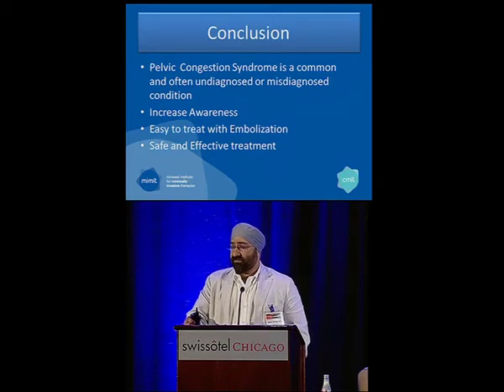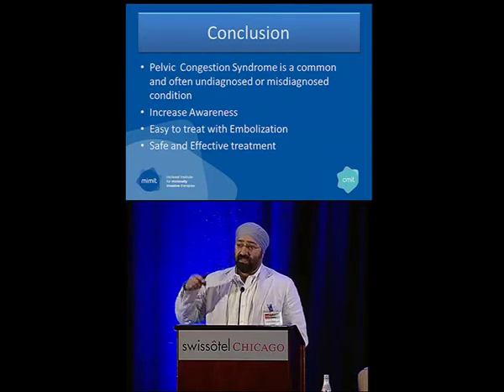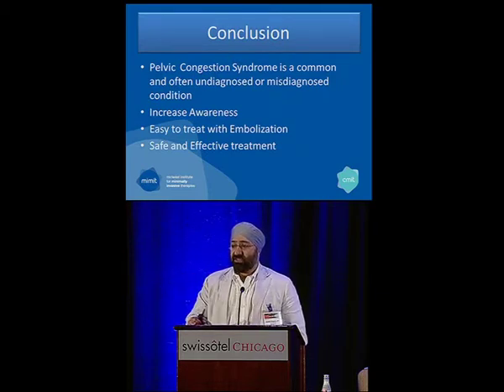One more comment, since everybody here is doing veins. When you see varicosities that are predominantly posterior thigh, and the saphenous looks okay, feel free to look at the pelvis because that's where it's coming from. That's something we do routinely now, because you can have perineal branches feeding a lot of them. So we've made it a habit to follow through even with ultrasound and see what's happening, and not just stick with the saphenous.